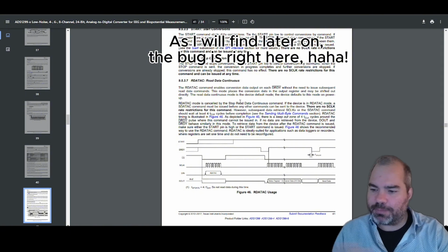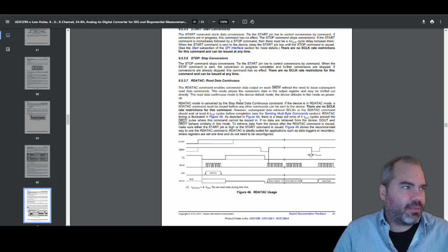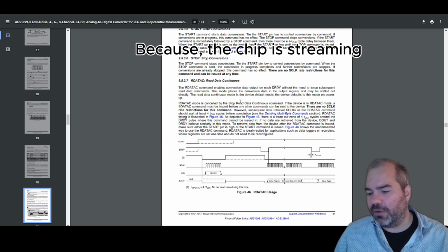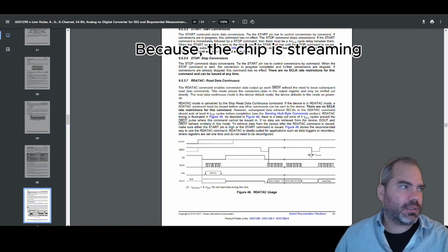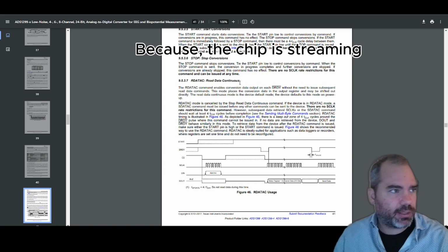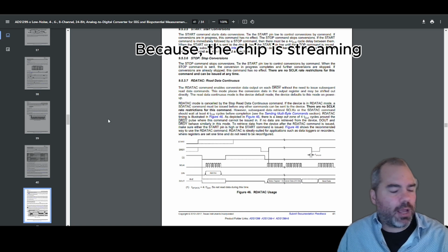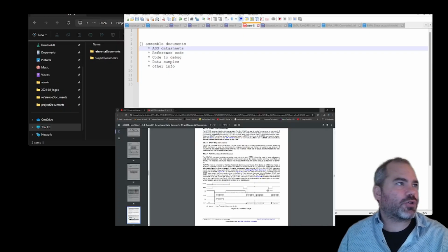Now, in the current scenario, we take for granted that the hardware is working properly, and that the startup sequence is working properly. So we're only investigating the program itself, the firmware. If we don't find any issues with the firmware, then we might roll back and try to figure out if this diagram is respected, but for now we take for granted that it's only the firmware, and most likely the data conversion itself.